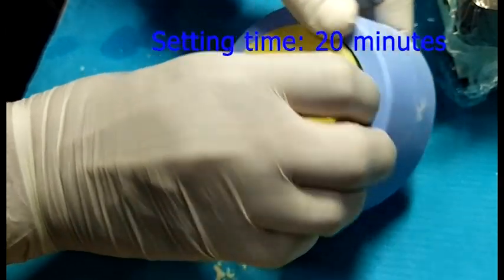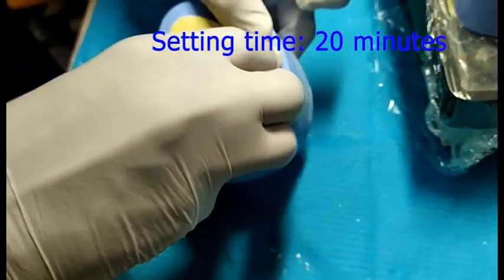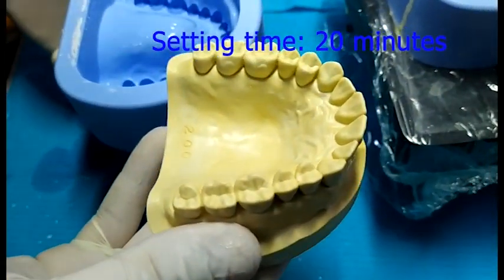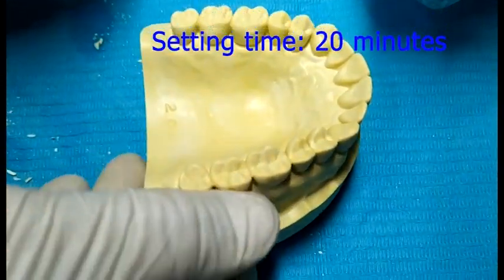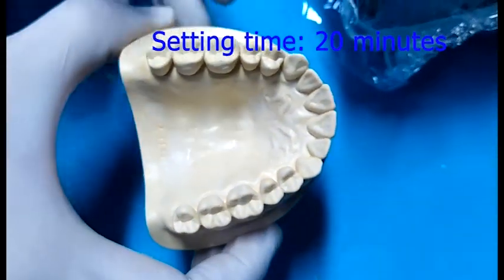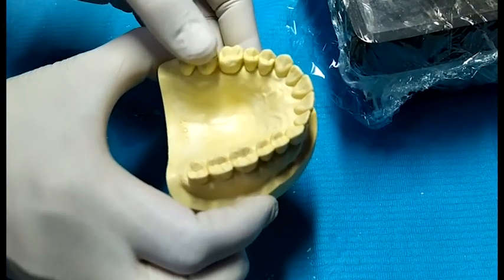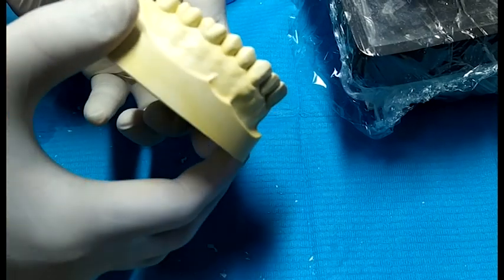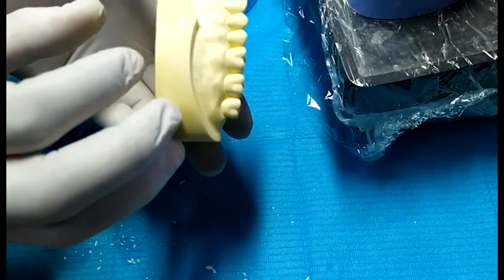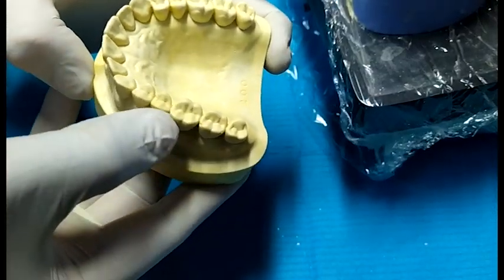Now we are removing the maxillary dental model from the mold. The molds are flexible, so you can easily remove the models from them. Now see the details of the maxillary permanent dental arch and the associated structures. There are no porosity or irregularities on the surface of the maxillary ideal dental model.